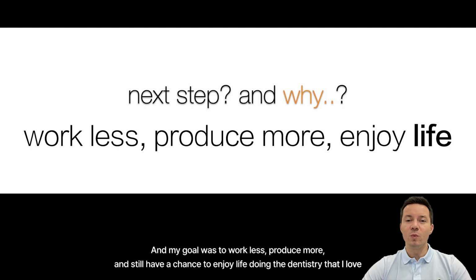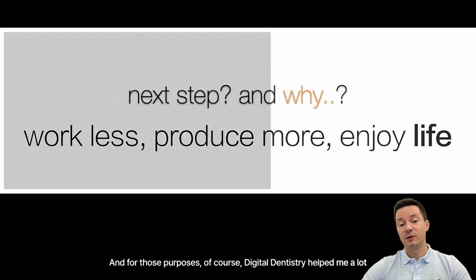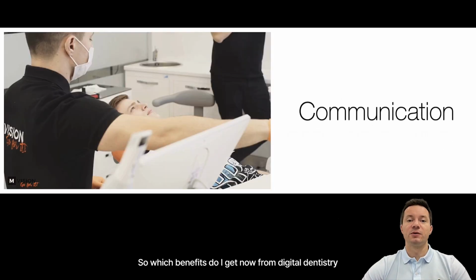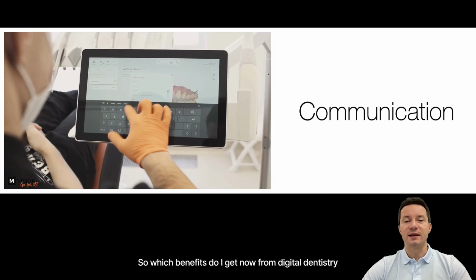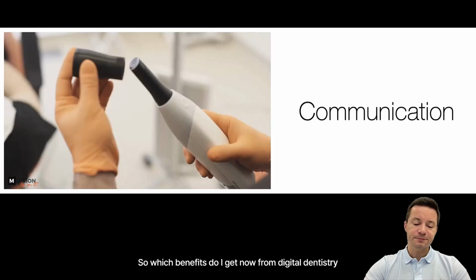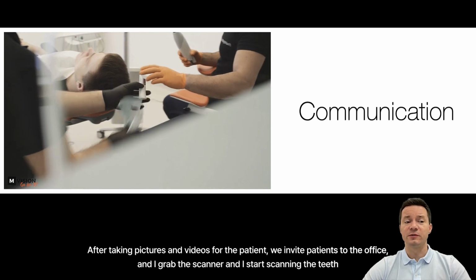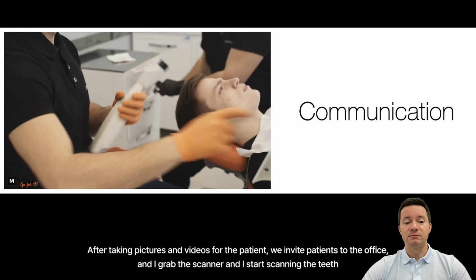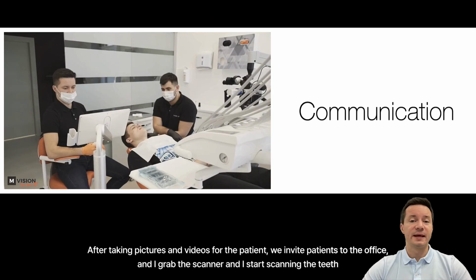And my goal was to work less, produce more, and still have a chance to enjoy life doing the dentistry that I love, actually. And for those purposes, of course, digital dentistry helped me a lot. So which benefits do I get now from digital dentistry? After taking pictures and videos of the patient, we invite the patient to the office, and I grab the scanner and start scanning the teeth.